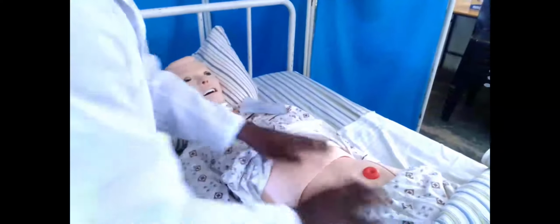So if you look at what we're talking about, you can look at the types of colostomy that we have around here. So we can remove the colostomy bag. Then we look at this patient. This is an abdomen.